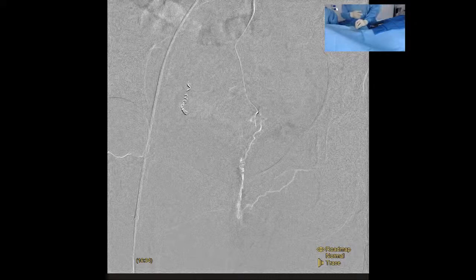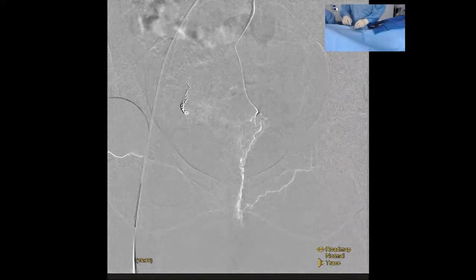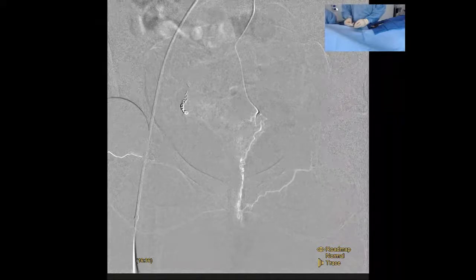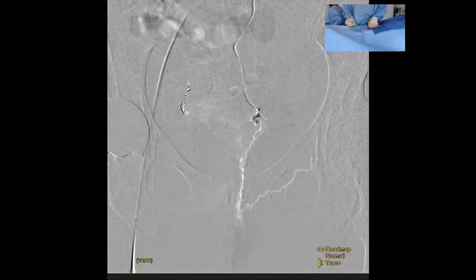If you do notice one thing here on the field, Ari, one thing you find interesting is that despite having this catheter, because of the amount of dead space eating up my base catheter, I don't really have a lot of microcatheter left. That's basically based on the length of your base catheter, right? Exactly. This is an 80 cm catheter base. So with that 80 cm, I'm now going at least 40 cm down towards this branch, and this is a 130 True Select. So a 155 would easily be a comfortable length to use.